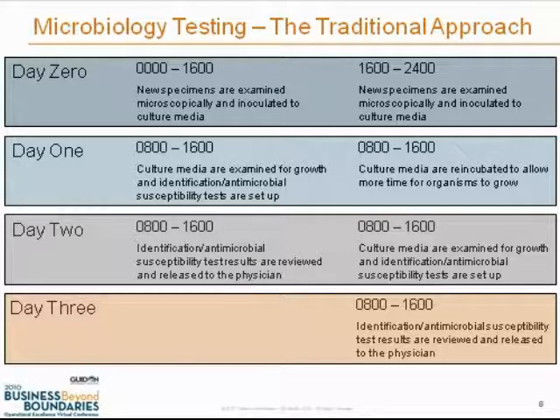on day 0. So yet another 24 hours has to go by before those culture results are finished and ready for release to the patient's medical record. So that's the traditional approach. Culture results can take as long as, more than 72 hours from day 0 to day 3, depending on the time of the day the specimens arrived in the laboratory.